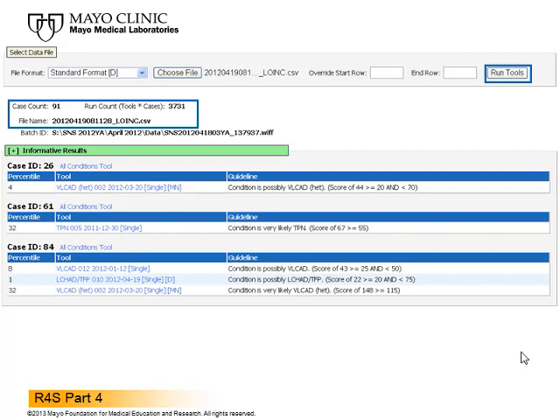Before discussing the report in more detail, it is important to explain how the system is designed to react to incomplete data sets, in order to prevent the incorrect assumption that a condition tool was not informative because one or more results were actually missing. In this instance, everything was in place, so no alert message was displayed to the user.